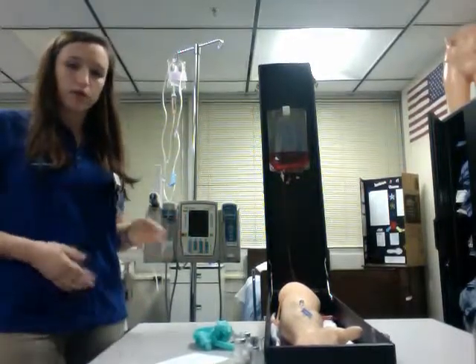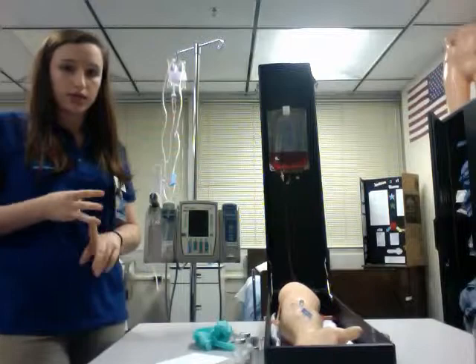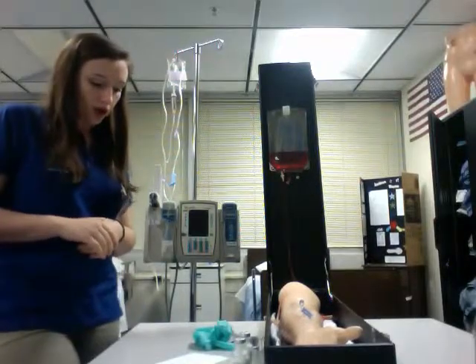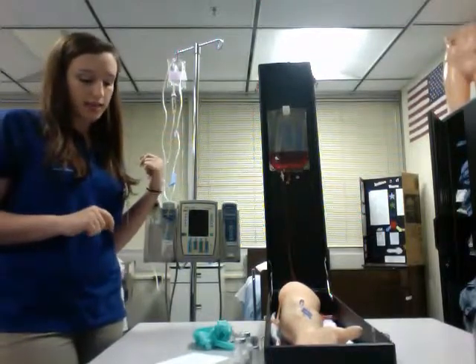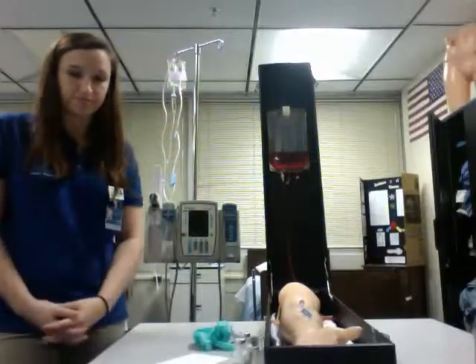So I would document what medication was administered, the time, drug, route, and dose, and also the condition of the IV site, which was good. I didn't notice any phlebitis or anything. I would also record the volume of fluid that I used to deliver the medication, which was 100 milliliters, and the I&Os. And that's it.